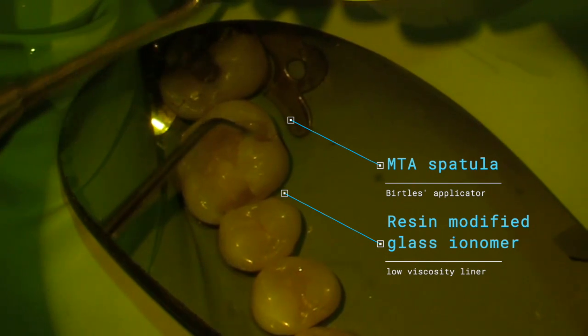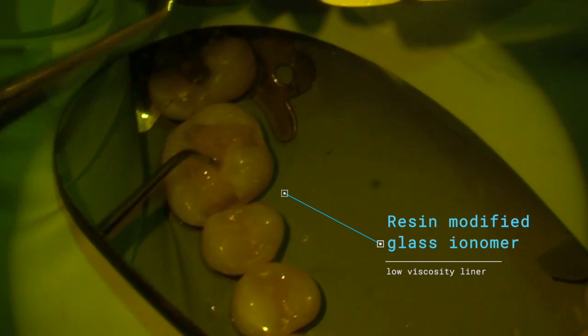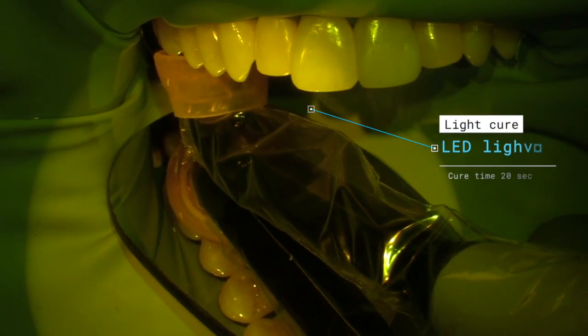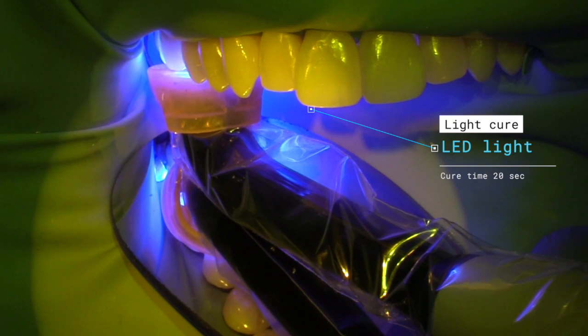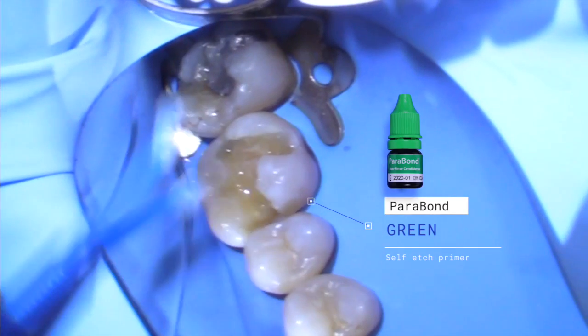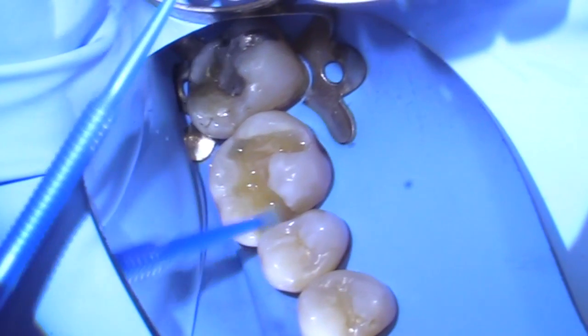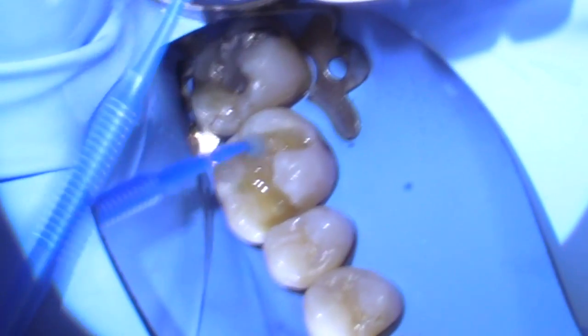I have a lot more than I need, so I'll just kind of go over here like that. I can spread some of that excess around the indent in here. I don't think that will cause any trouble. This will basically allow us to bond the Parabond material into position. We don't need much of this, and then after this we do a little prep.